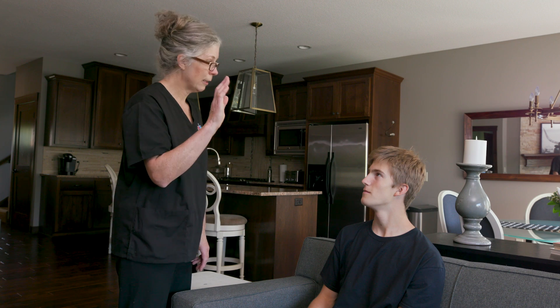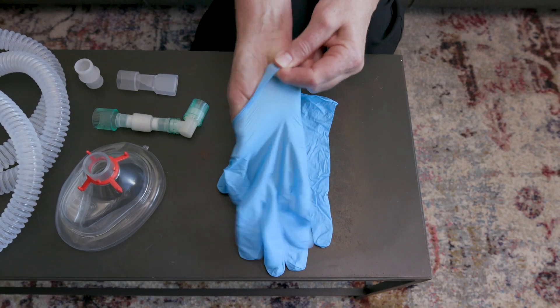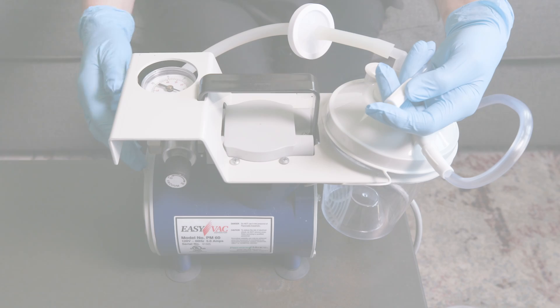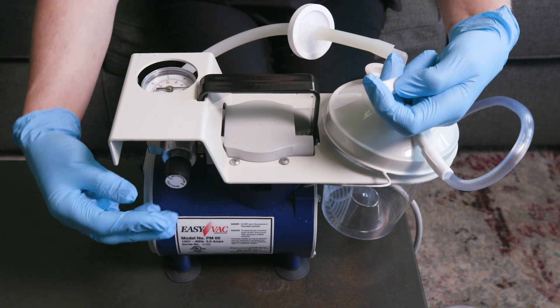Identify a signal the patient can use if they need to stop the session. Put on the non-sterile gloves. If the patient uses a suction machine, check to make sure it is functioning properly.